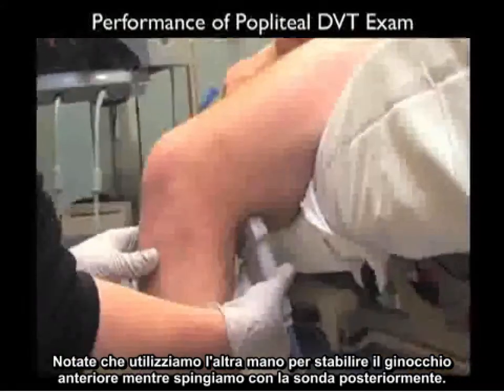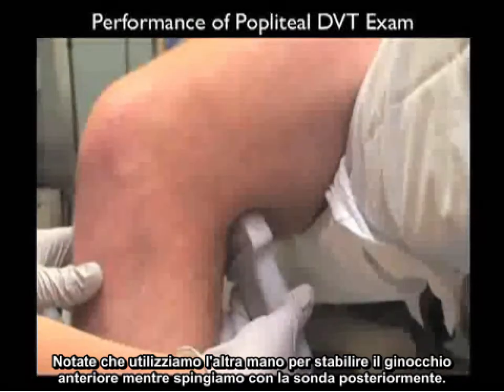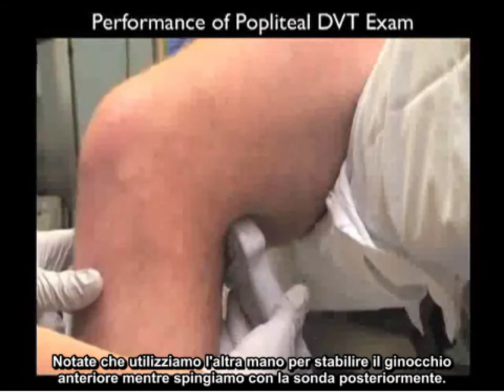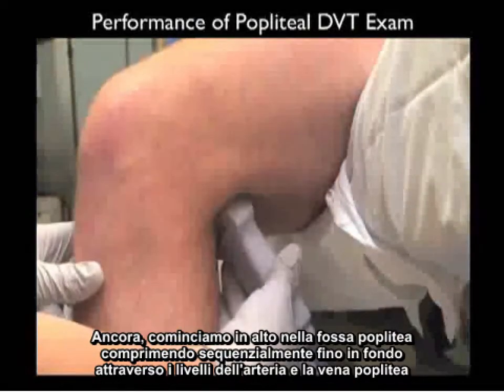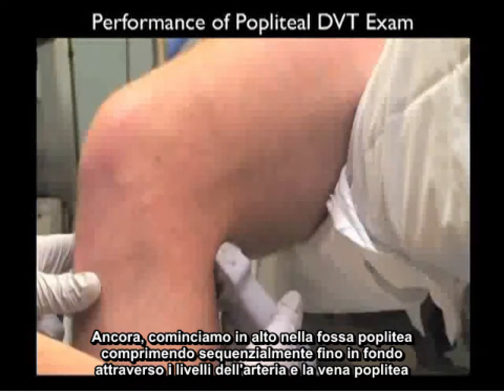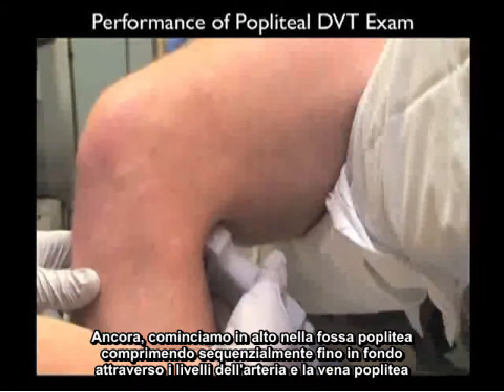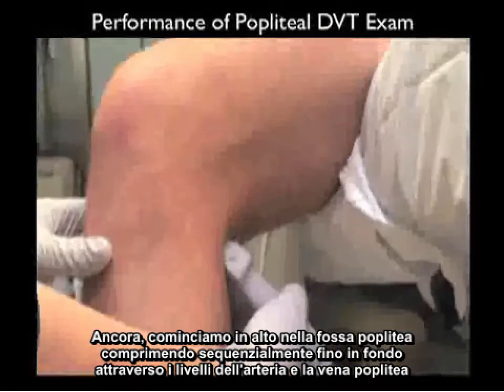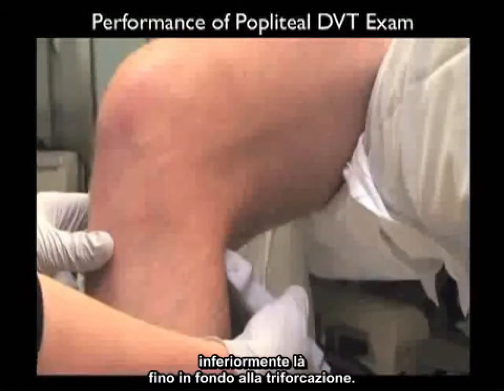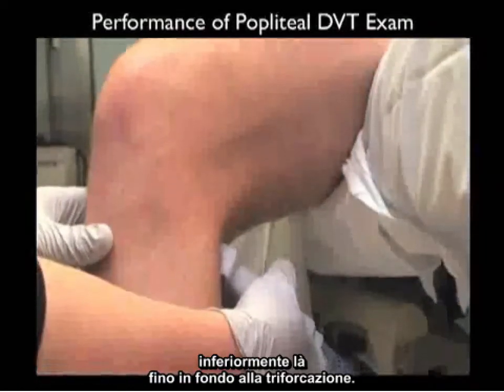Notice that we're using our other hand to stabilize the anterior knee as we press with the probe posteriorly. So again we'll start high within that popliteal fossa, compressing sequentially all the way through the levels of the popliteal artery and vein, down all the way to trifurcation.